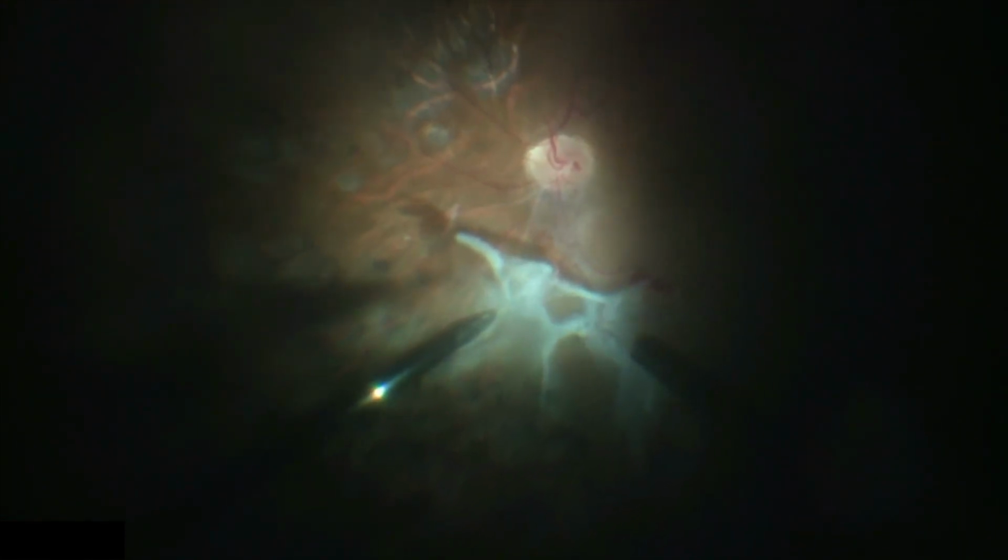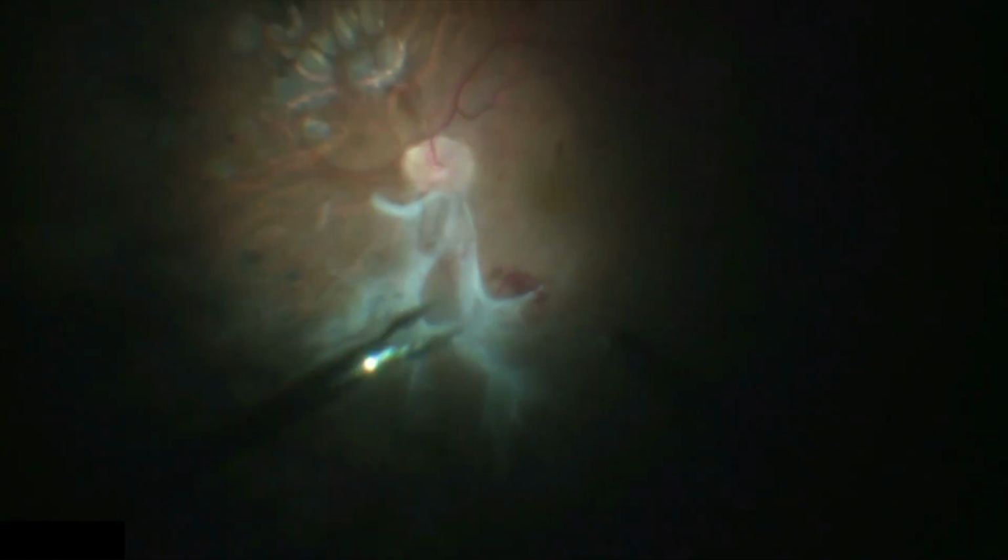In this clip, we see the technique of fold-back delamination, where the membrane folds on itself and it is fed to the cutter, increasing the safety of the procedure. Sometimes the membranes can be removed as a single sheet, as we can see in this clip. This technique is known as en-bloc dissection.